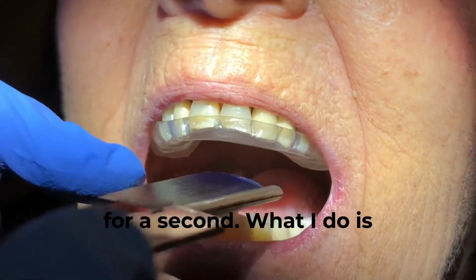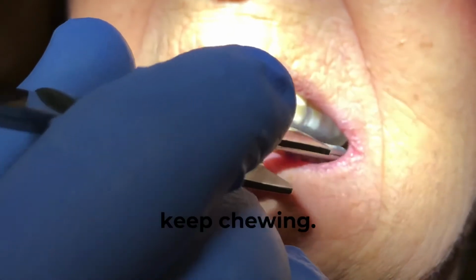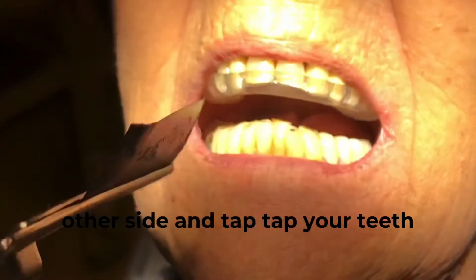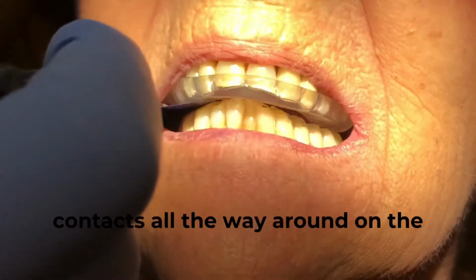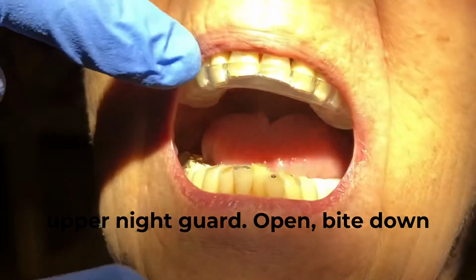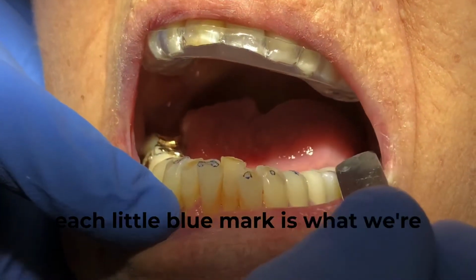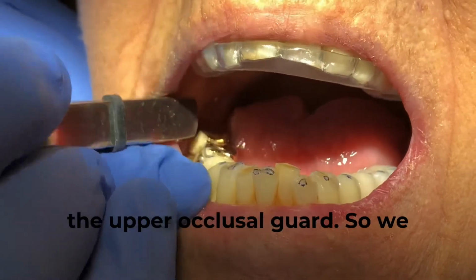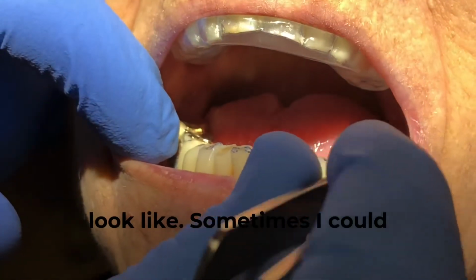Open for a second, and what I do is put a little marking paper between the teeth, and you could chew up and down on the paper. Tap, tap, tap. Keep chewing a bunch of times. Excellent. And let's do the other side. Tap your teeth together. These marks demonstrate what I'm looking for, equal contacts all the way around on the upper night guard. Open, bite down tight. Good. All right. So here we can see each little blue mark is what we're looking for, so it's equally contacting the upper occlusal guard. So we have equal forces distributed around, and this is what it really should look like.